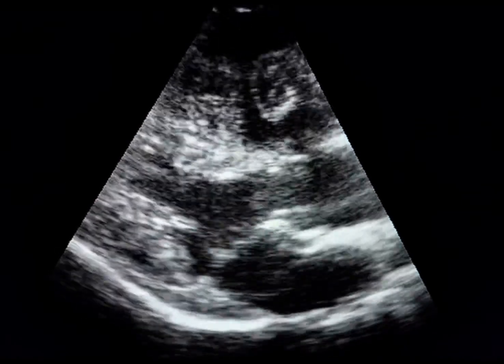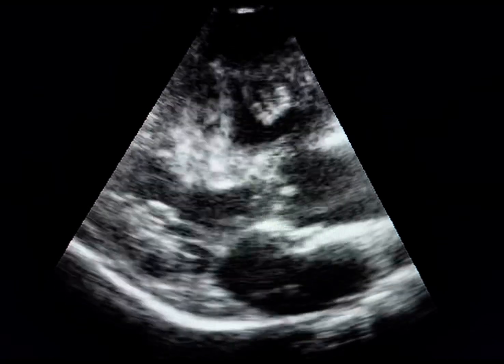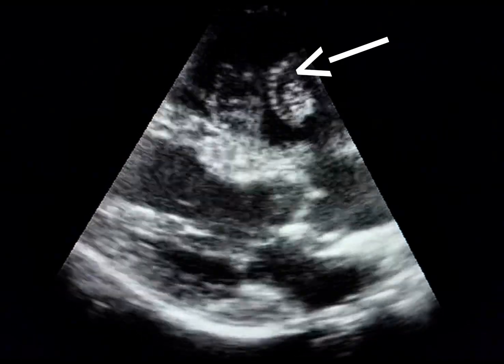This echocardiographic study is of a 57-year-old man presenting with chest discomfort. As seen here, there is a large mass in the right ventricular outflow tract.